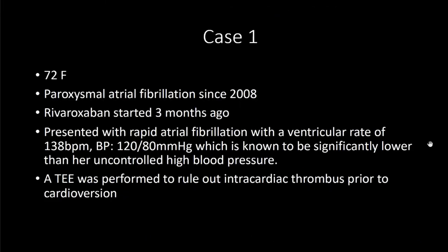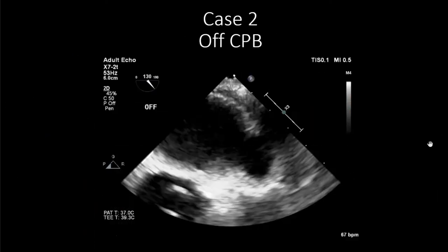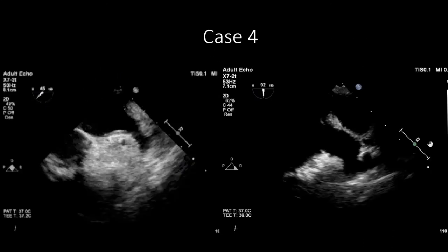This is a case of a 70-year-old gentleman who presents with permanent atrial fibrillation, meaning we've given up on trying to get him back to normal rhythm. He had a variceal bleed, so he can't have oral anticoagulation, and he's now being worked up for left atrial appendage closure by device. Before going to the device, we have to make sure there is no clot in the left atrial appendage, and we also have to assess for size. There are papers showing you should try to ensure these patients are a little fluid-loaded so you get the appendage a little larger — to get the most accurate sizing for the device.